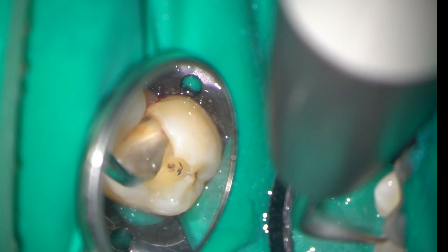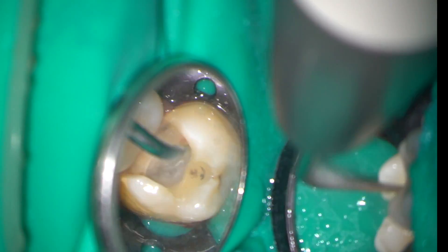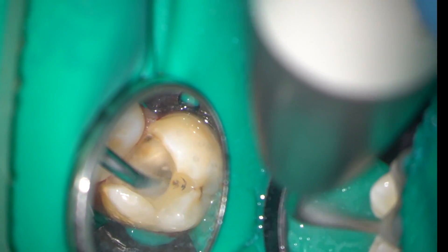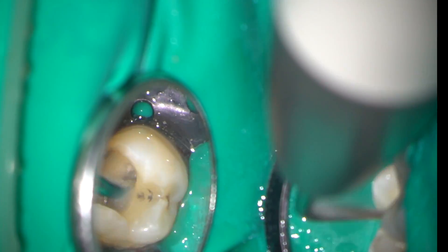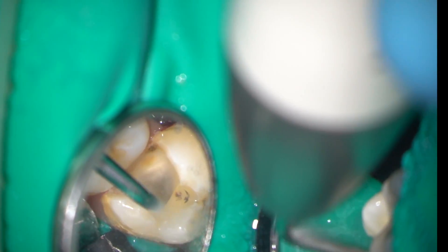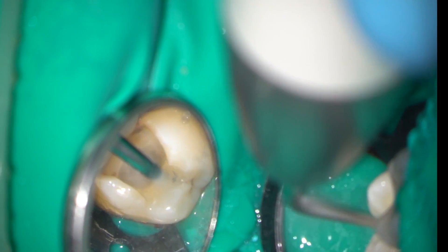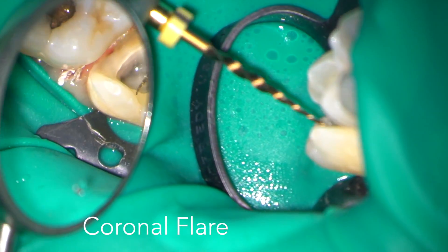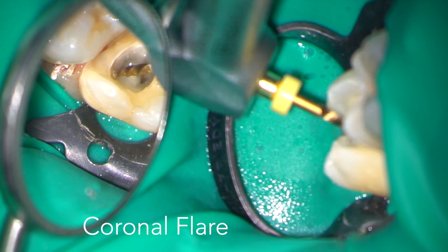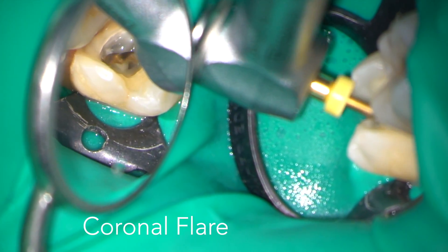I've now got good visibility of the pulp floor and I can see the orifices of all the root canals. The first stage of preparation involves coronal flaring, which removes any obstructions at the level of the orifice. In this case I'm using a ProTaper SX instrument, but you could use a Gates Glidden burr or a rotary or reciprocating instrument.